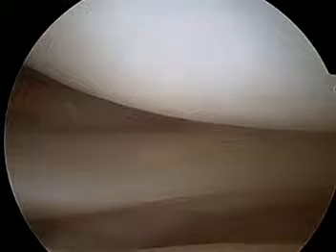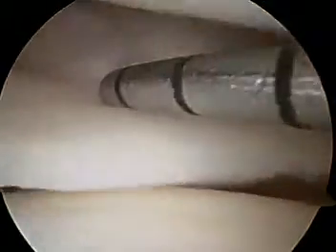Now we're going to slide on over into the lateral compartment of the knee joint. And this looks much better than the medial side. Get my probe in here, switch this around, get all the cords out of the way. Okay, now I got my probe in. We see the thigh bone on the top, the shin bone on the bottom, the lateral meniscus over here. And indeed, the lateral meniscus looks good. We see the popliteal tendon back behind the knee, its continuation below inferiorly. The articular cartilage on the femur looks fine there.